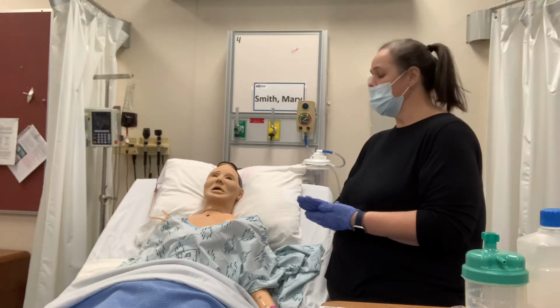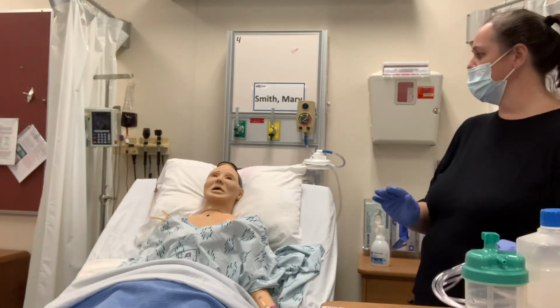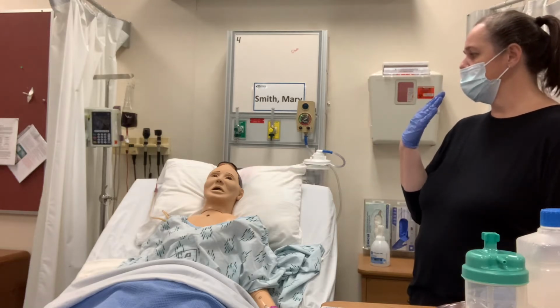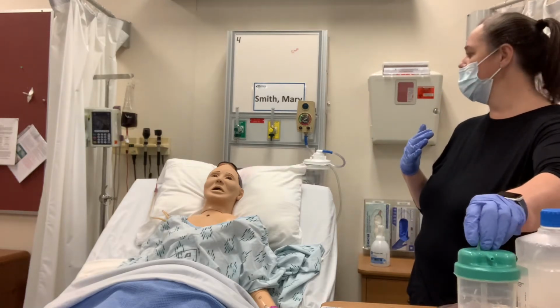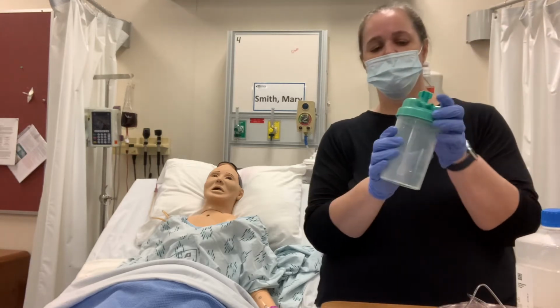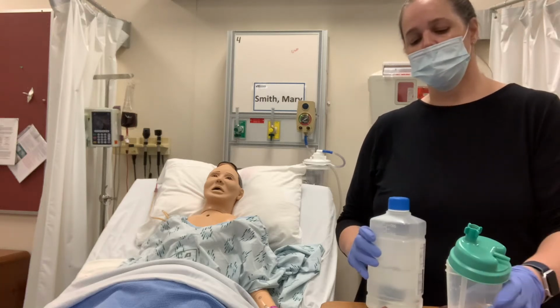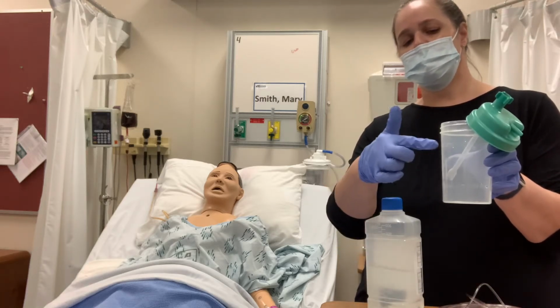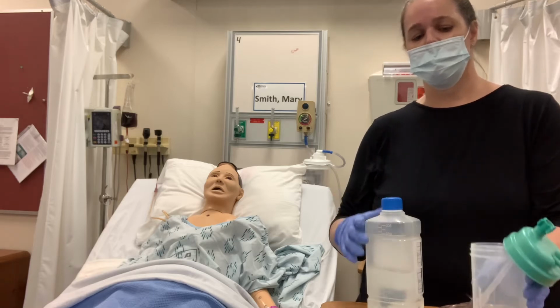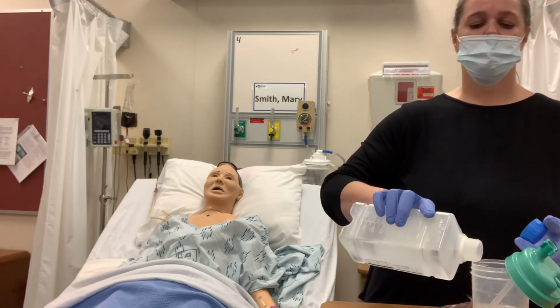So Mary, I'm going to go ahead and put some oxygen on. I'm going to put it on at 2 liters by nasal cannula. And because it can be a little irritating to your nose and mucous membranes, I'm going to go ahead and put humidification with it. So to prepare my humidification, I'm going to make sure that I'm using sterile water for inhalation. And I'm going to fill my humidification bottle in between the minimum fill line and the maximum fill line. So I'll go ahead and add water to that level in between those 2 lines.